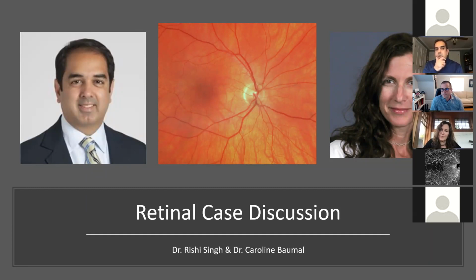And so that's a really easy way of following it rapidly, rather than consuming ourselves with looking at these individual compartments per se. The other thing I'll tell you is there's been a lot more studies on the OCT variability, right? How much does your OCT change from the time they're getting active until the time they're getting inactive? Is that sinusoidal wave 20 microns, 30 microns, 100 microns? Because that in itself is a marker of bad activity.